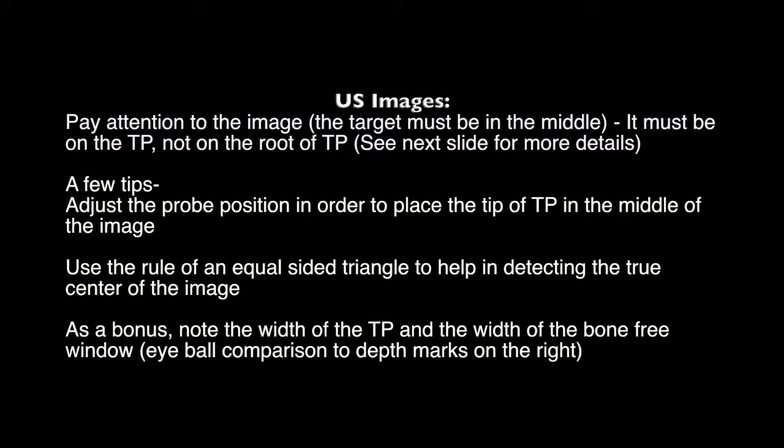A few more tips: Adjust the probe position in order to place the tip of the TP in the middle of the image. Use the rule of an equal-sided triangle to help in detecting the true center of the image. As a bonus, note the width of the TP and the width of the bone-free window.